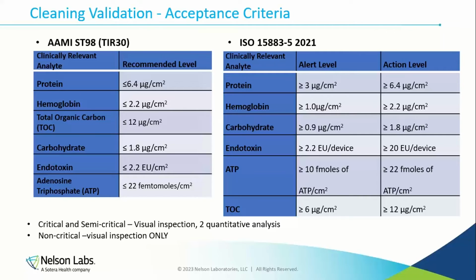The one thing that came out really well for AAMI ST98 manufacturers was that for non-critical devices, visual inspection is required. That's it. So no more analytical markers for non-critical devices. Visual inspection suffices. We don't have to do more than that anymore. So that's a plus that came out of this document. It definitely helps move along these devices that we did testing for that really didn't help mitigate infections or risk or anything. It was just there because we didn't know what to do with it. So I'm glad that this helped the industry move along.